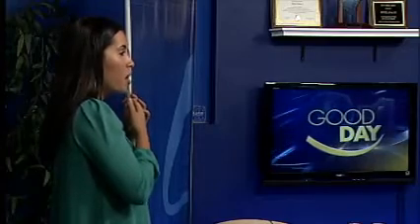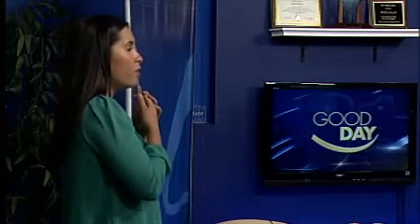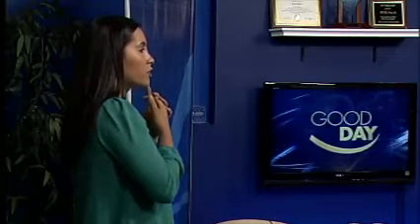Hope so. Okay, so Sasha, you go ahead and conduct the experiment. Sure, so cover your left eye. Perfect, and keep that right eye open. And can we read this one? Oh yeah, HVZDS. Let's start down here. DVOHC. Great, and here. HGCKO. And here. ZHCSR. And the bottom one? I can't read. It starts with an R.